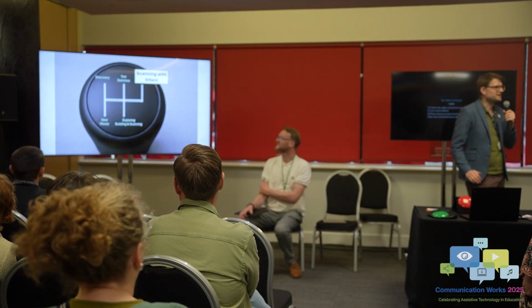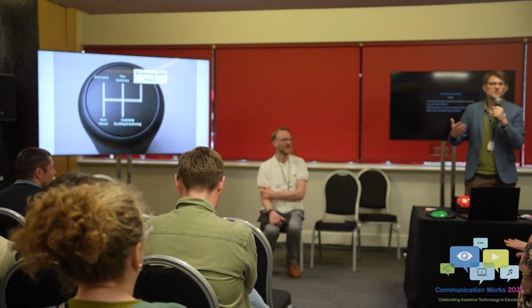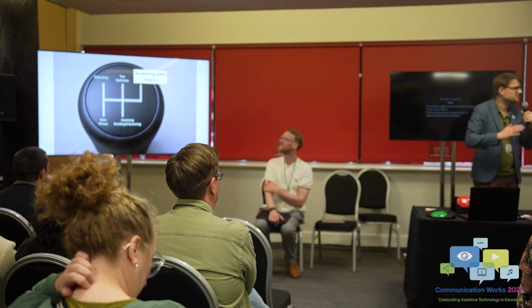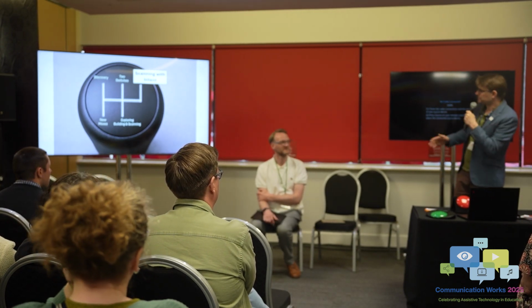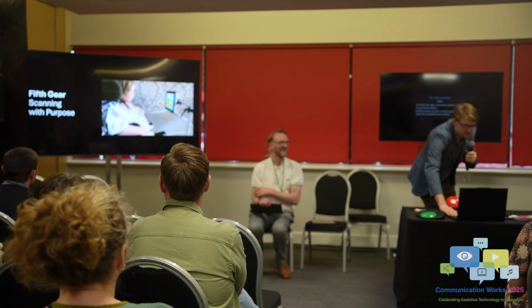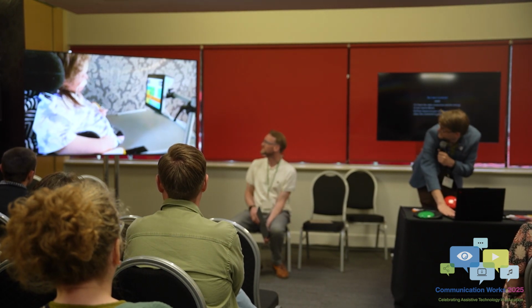5th gear. Okay, so 5th gear is where we stop measuring success with the switches, and we start measuring success with the communication aid or the access to education or whatever other standard measurements. And you'll be pleased to know this is the last little video. This is somebody scanning with intent in 5th gear with her communication aid.